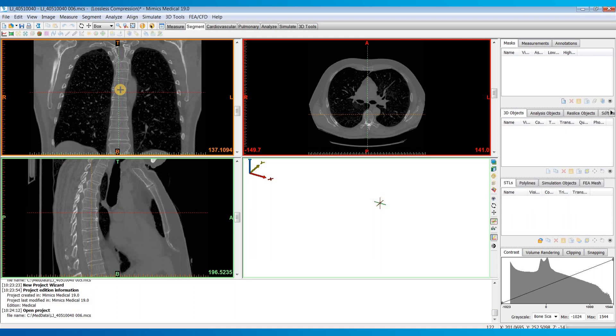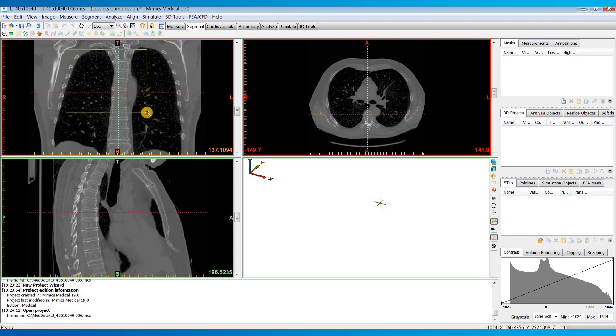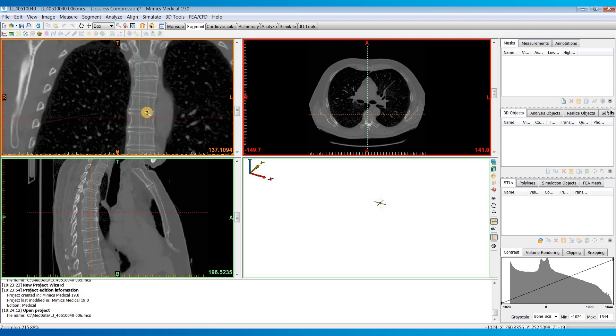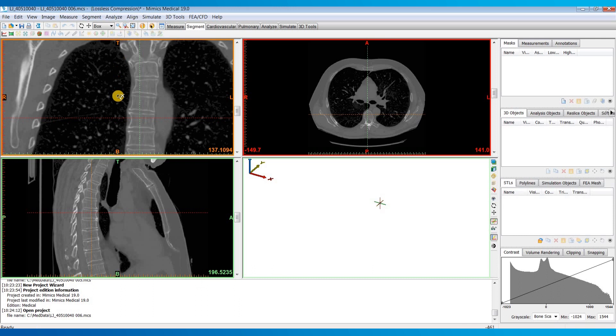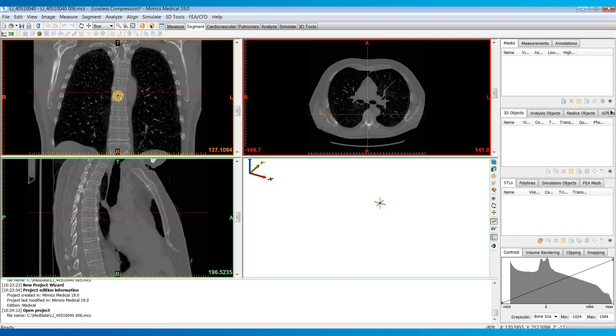If you'd like to zoom in and out of the images you can click on this magnifying glass up here and then drag a rectangle around any region you want to zoom into. To zoom back out click the magnifying glass with the red X and then back on your plane left click and it will zoom back out.